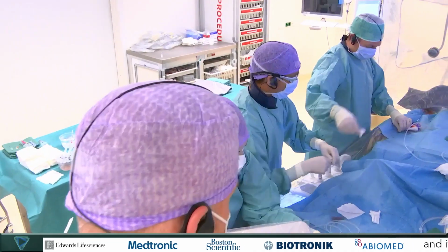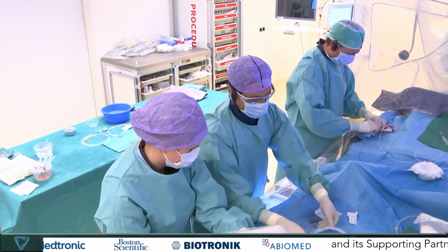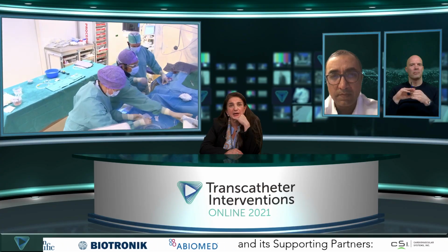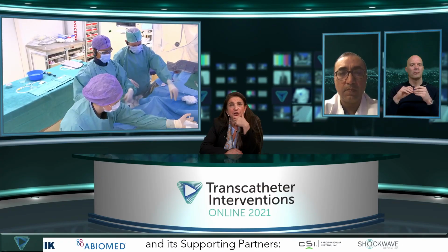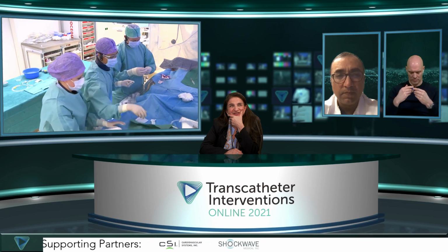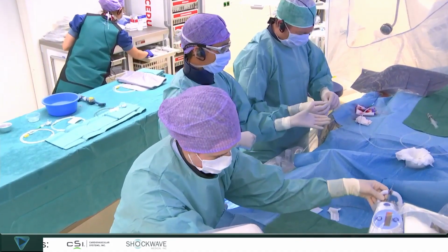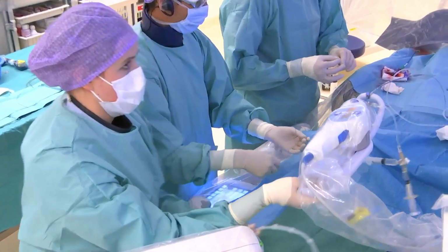Yeah, I suggested that, but I also respect their idea of wanting to take it slow in their early use of this device. But that's probably what we would have done. Go just one run on the higher energy in this larger proximal vessel. But let's see what you got. You know what? The good thing is this Viper wire is not too bad. We will deliver the IVUS catheter over the Viper wire, and if we're not happy, we can do another run on high speed proximally.